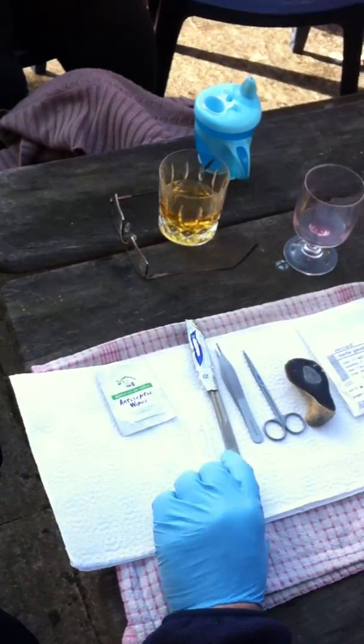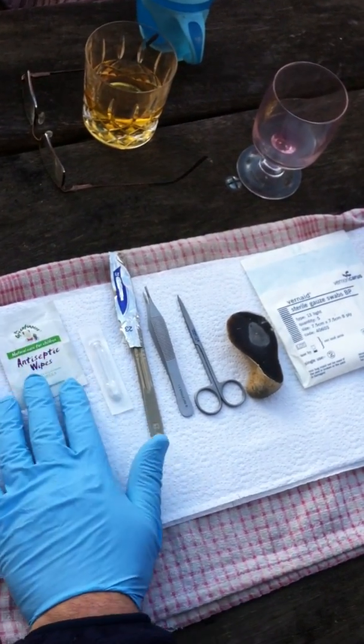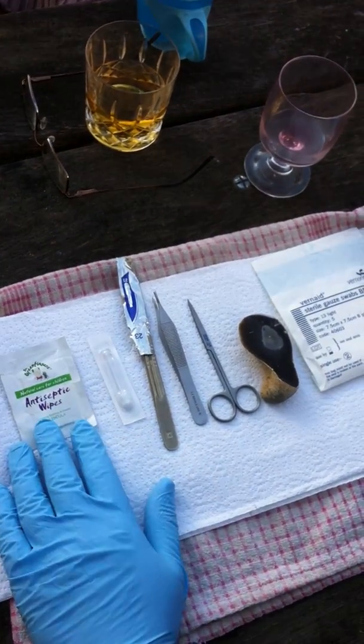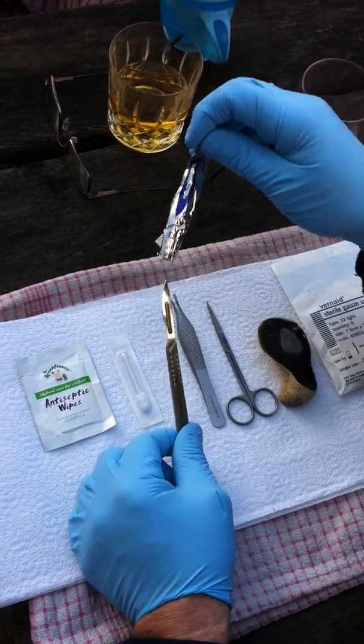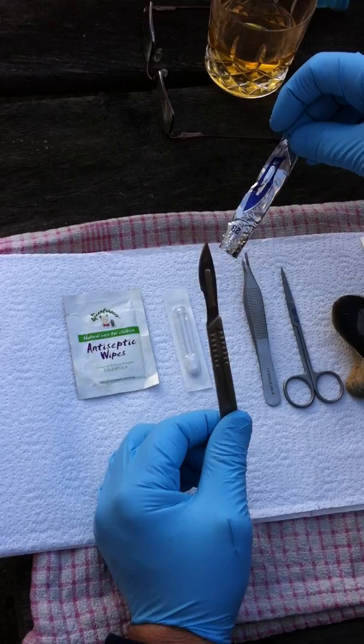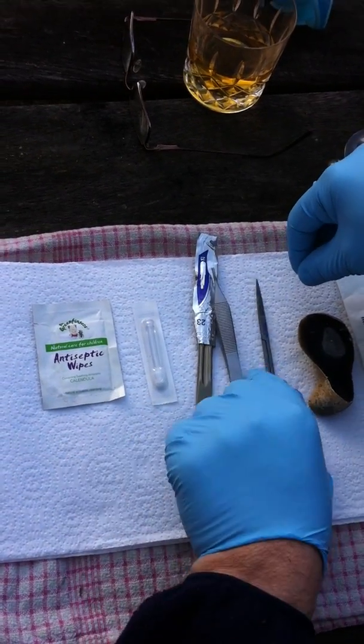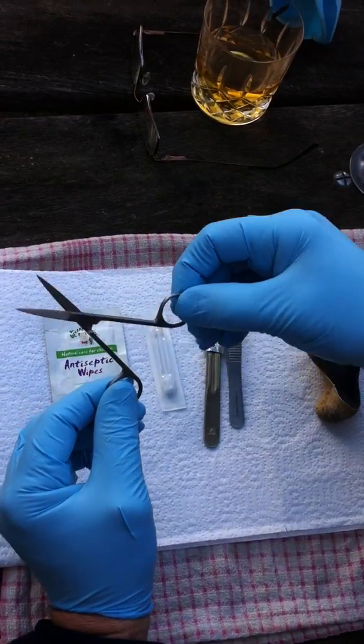Well, here we are with the procedure. We're going to give our patient the option here. You can have a proper modern sterile scalpel with blade, or you can have a nice pair of sharp iris scissors there.